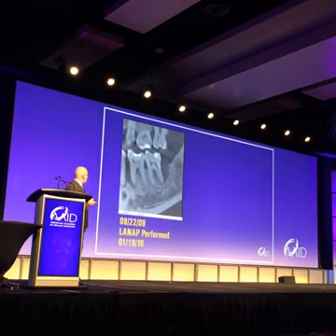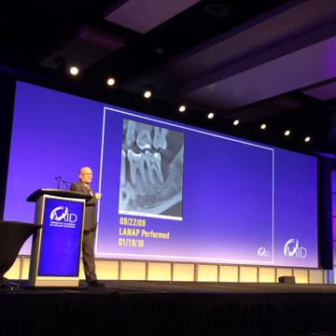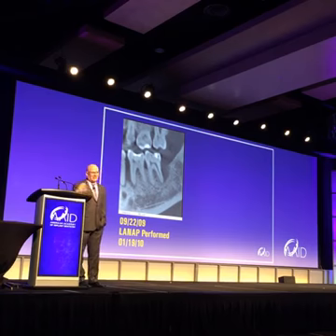We're going to look at tooth number 18 and 19 mostly. You can see the amount of bone loss. How many here would take those 2 teeth out? Okay, just go ahead and admit it, it's fine. Is it a bad treatment? No, it's what most of us would do. I didn't expect anything to happen.